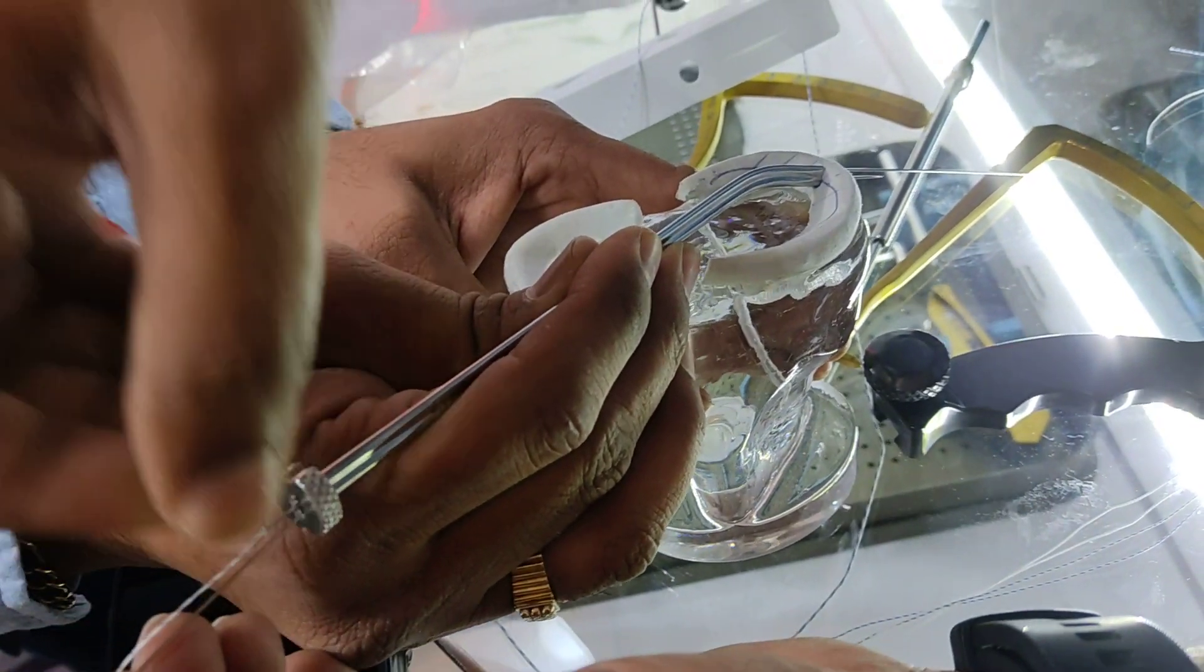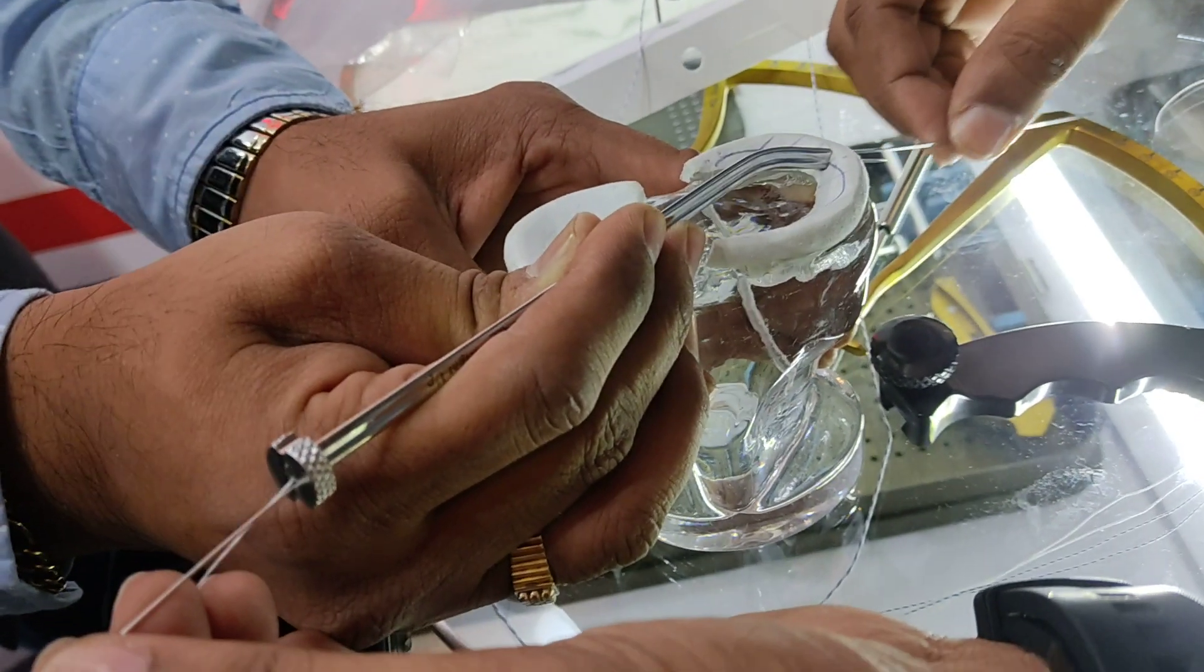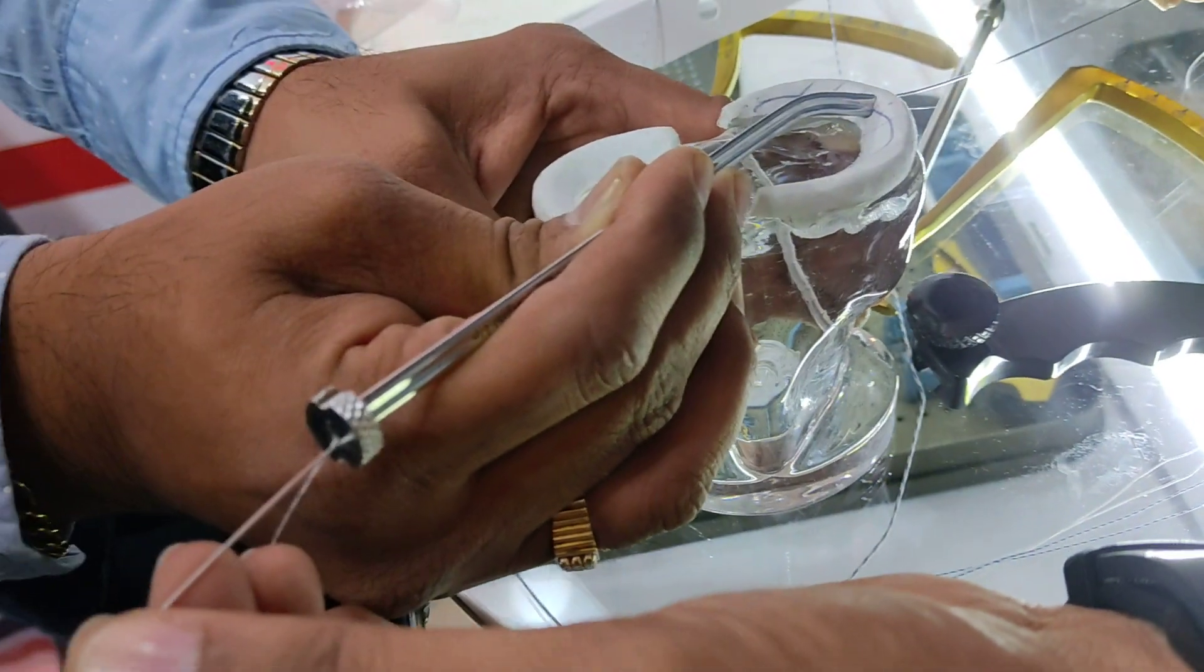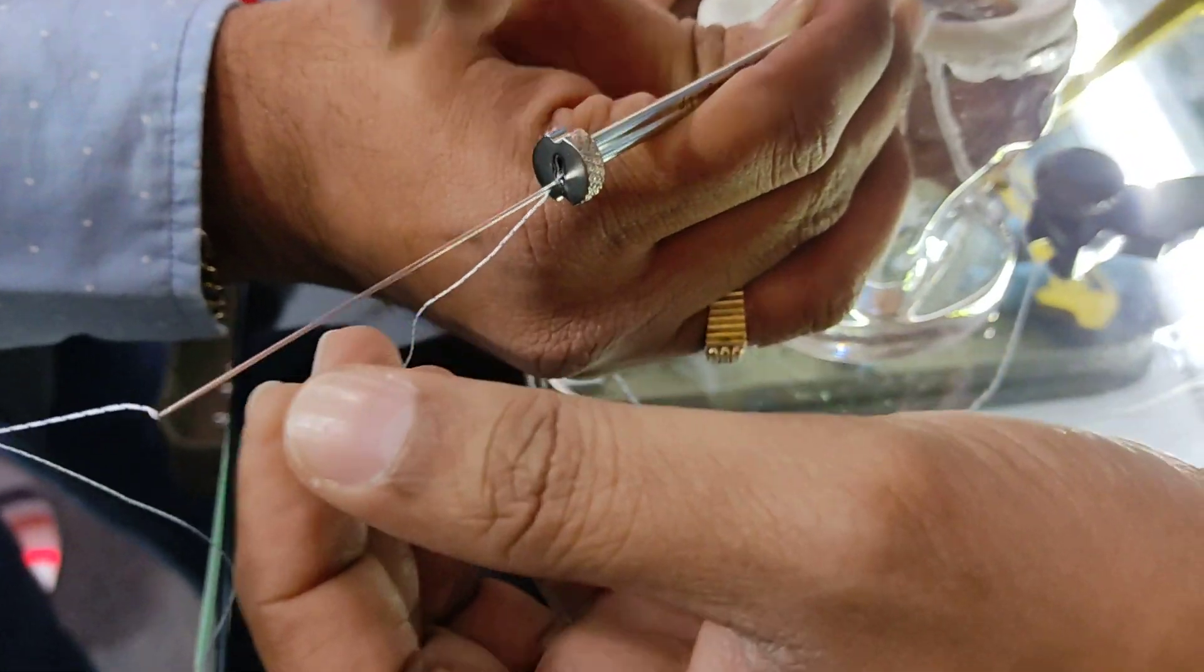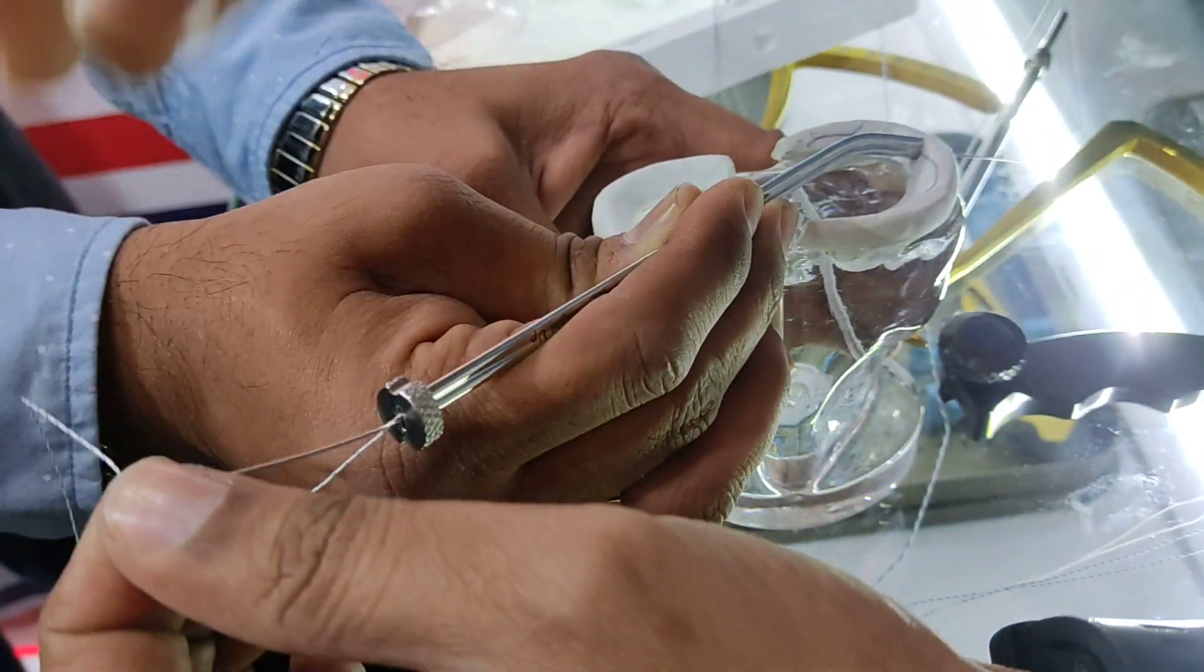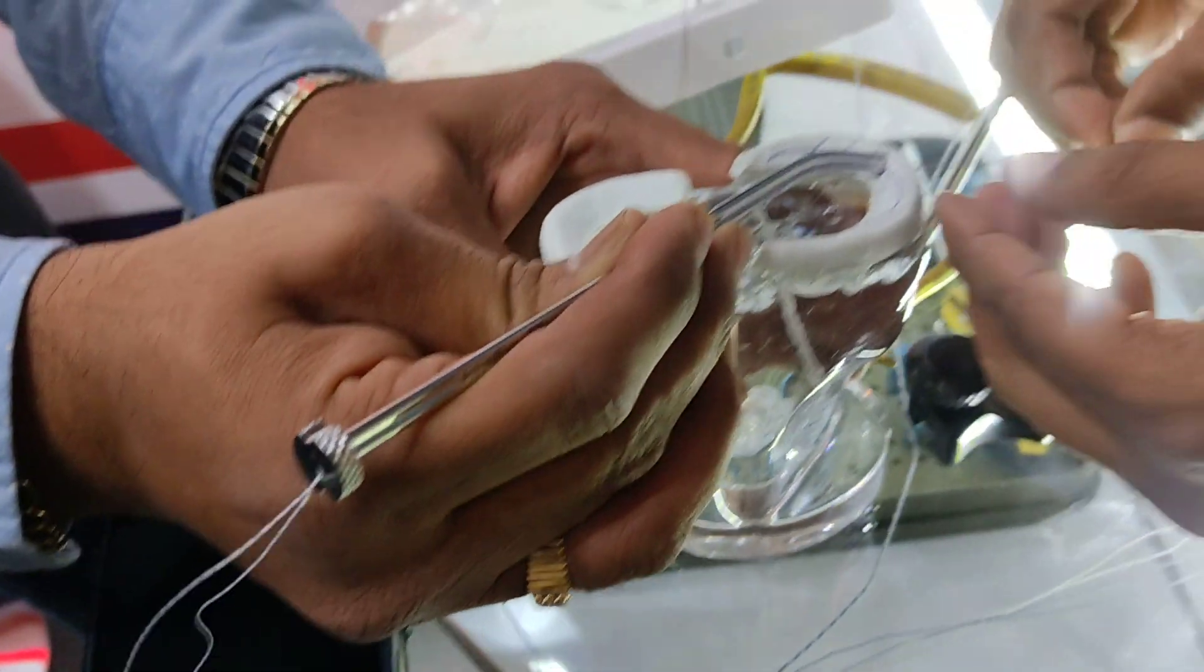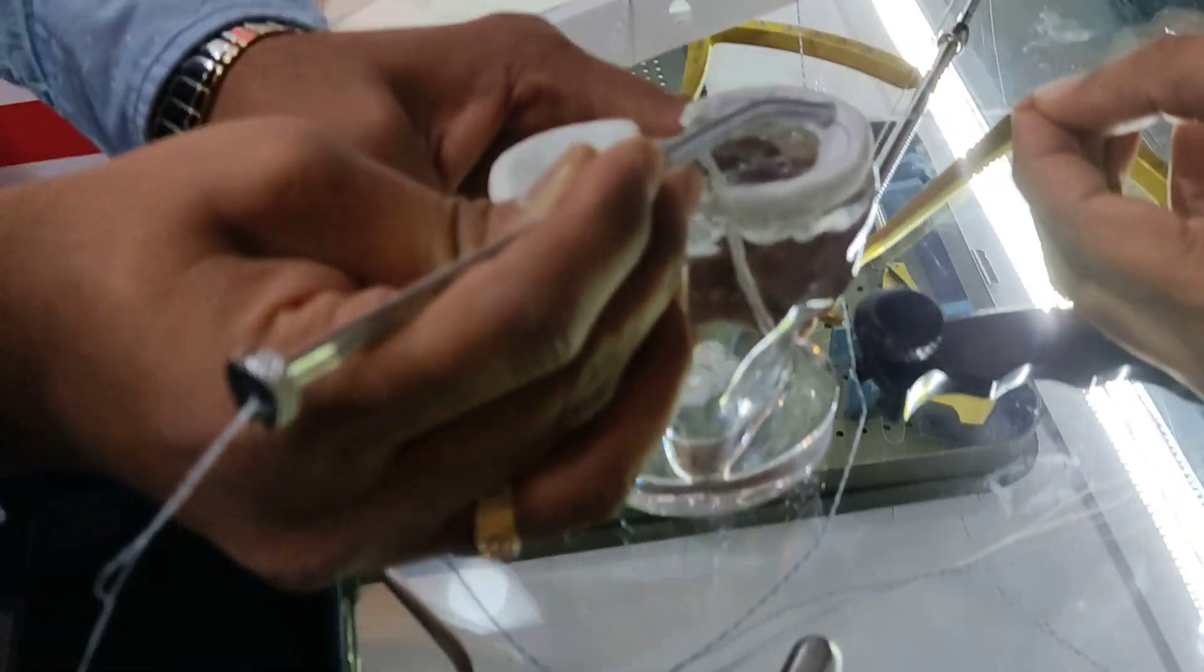Friends, this is an inside-out technique of doing meniscus repair. These cannulas are already pre-bent, so you can see this. They are providing two needles which have got a thread, so based on the location of the tear you can place your bent cannula.